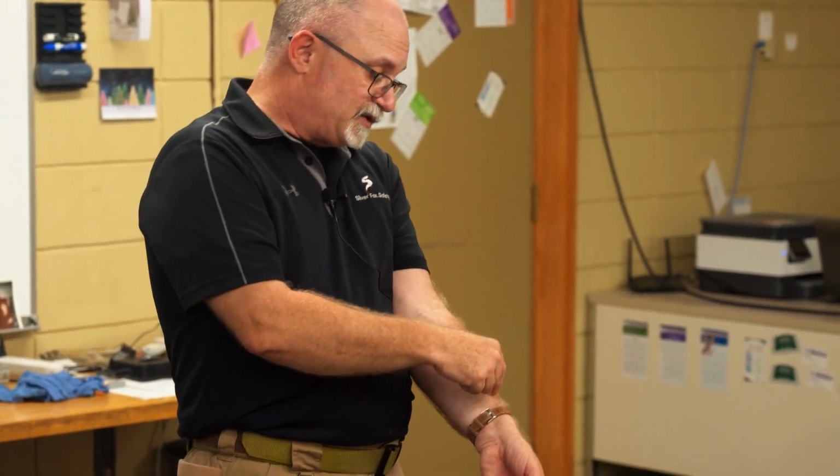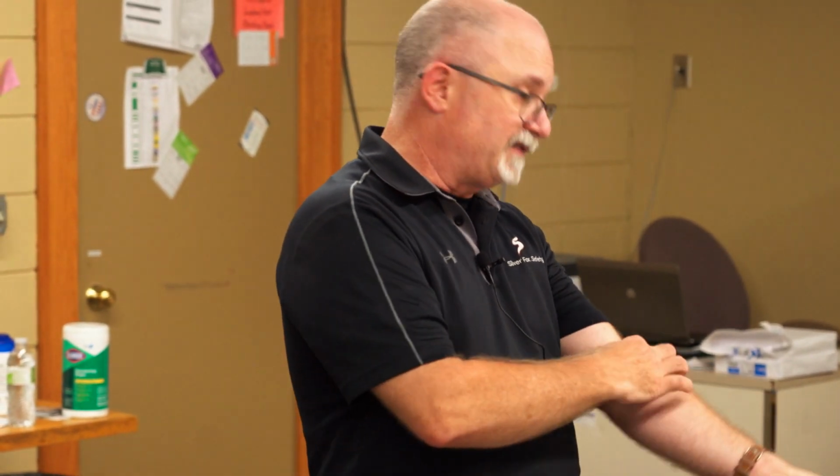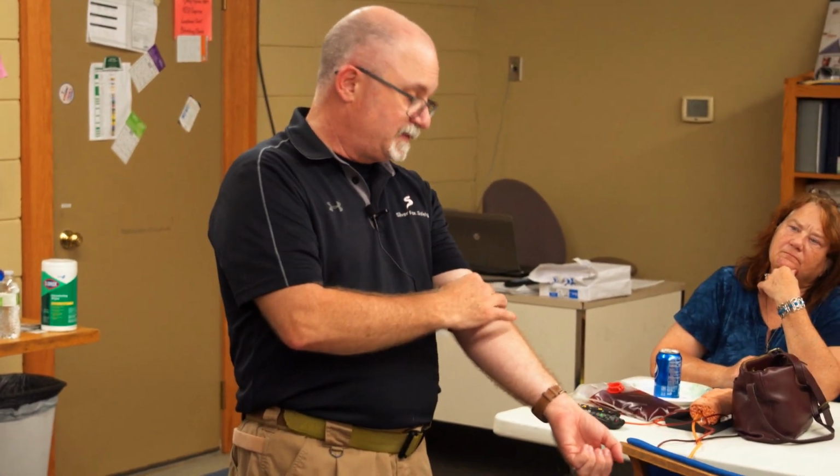So now you're into the tissue outside. And so when you're flushing or flowing it, if we put it in the hand and now we see a little bubble forming up above, we need to stop the IV, pull it out, put direct pressure on it, and we want to catch that the sooner the better. On the back of a hand, it's usually easier to see. But even up in here you can still see it.